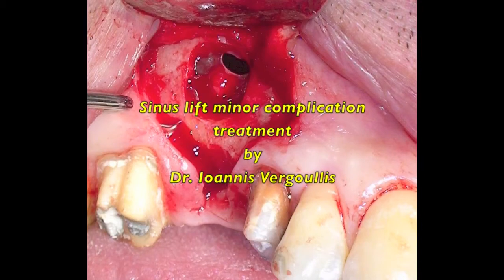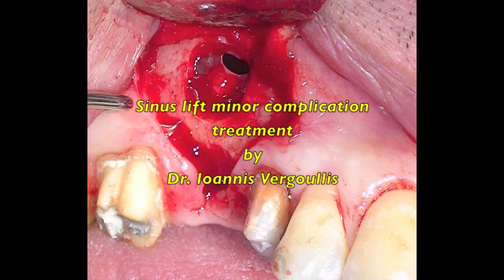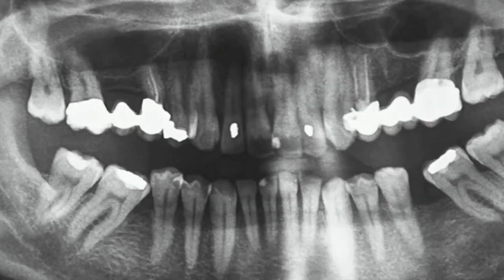In this case we will describe the technique we followed in order to overcome a minor complication of sinus membrane perforation during sinus lifting.